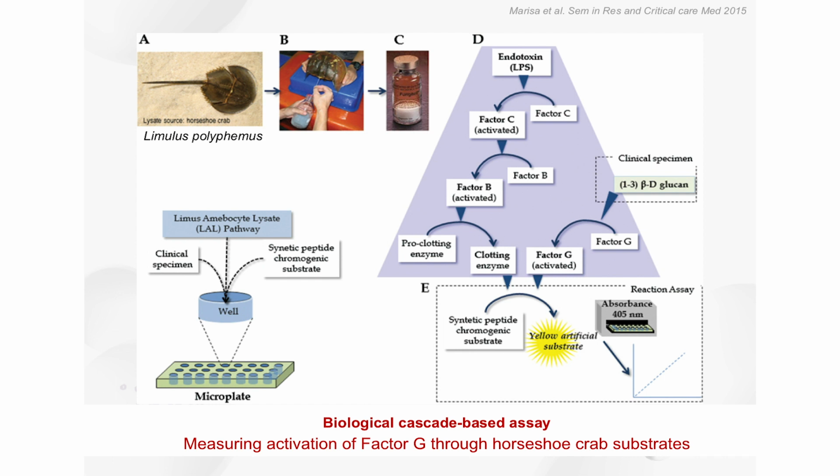And then there is a synthetic peptide using the ELISA, and it shows a reaction that we have to observe over the timeline here. And we analyze using the data, the Gen5, which is not so cheap. It is costly too.